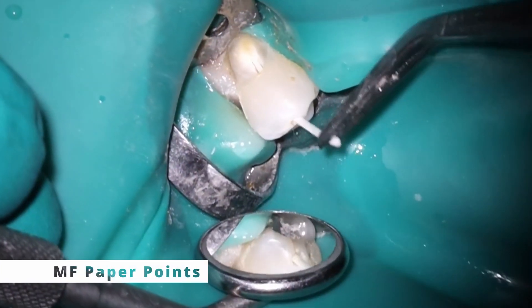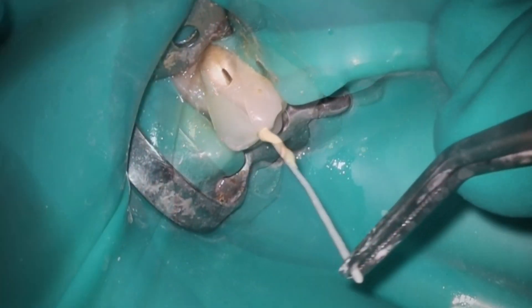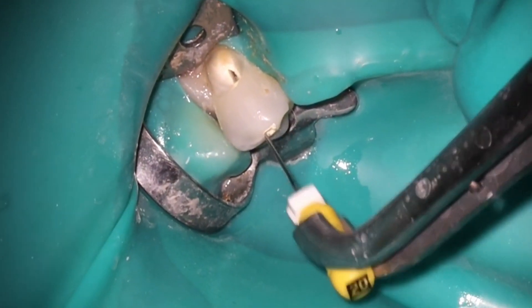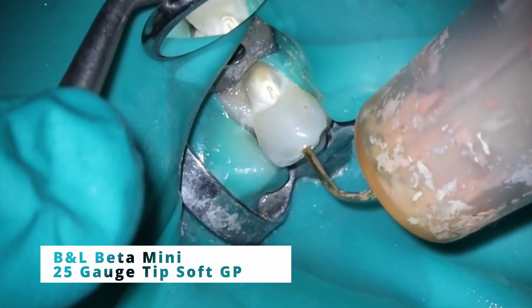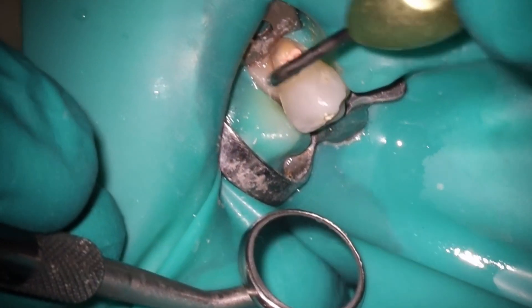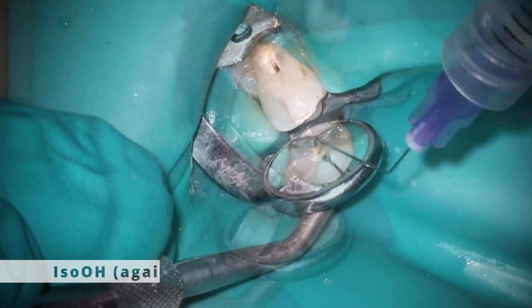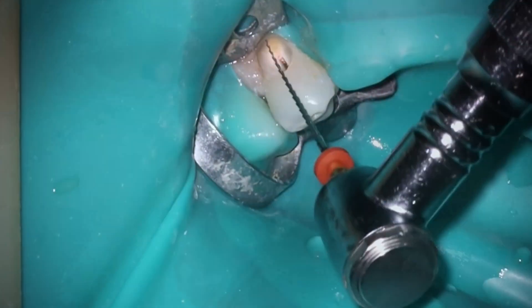Isopropyl alcohol, clean everything out — looks nice and dry. We're going to get ready for the squirt fill just like normal. Nothing too crazy about this tooth from a root canal standpoint; the question is whether it needs a crown. When I do the squirt technique, I'm only placing a small amount and trying to keep it out of the coronal part of the access so I don't have gutta-percha sticking around inside there. Then we clean it out — I went back in with isopropyl alcohol to make sure we got all that sealer out, and now I'm going to use the PacMac.